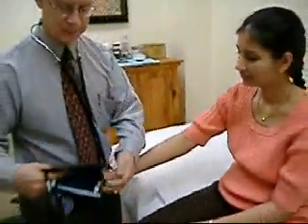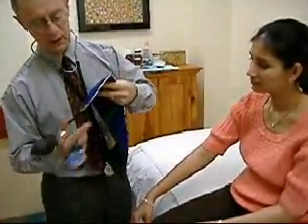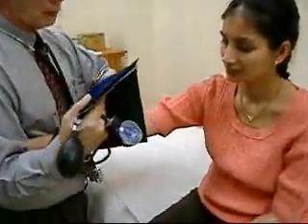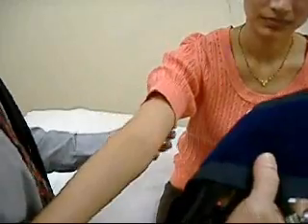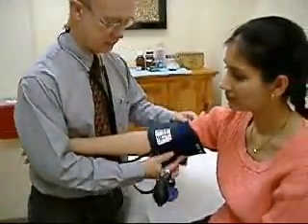Now we're going to take the blood pressure on her non-dominant arm again. Once again, to control the tubing, this finger goes between here, slides down, grab the corner, fold it over — fuzzy side down. Take the wrist. You want to make sure the palm is uppermost, because that takes the tendon of the biceps brachii off the brachial artery, and makes it much easier to hear. And at my age, I need all the help I can get.